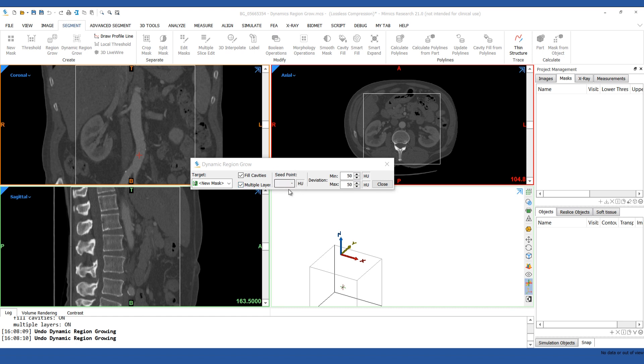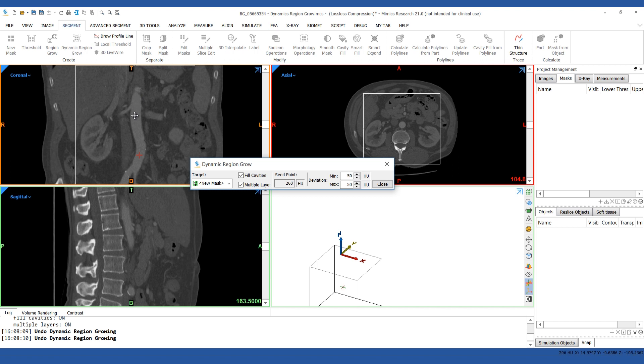You can see that as you move your cursor around, the seed point value changes based on what pixel value your cursor is currently over. Once you choose the seed point, it is going to grow out to any of the connected voxels that are within the deviation of the chosen intensity value. Let's go ahead and just left click in the middle of the aorta.